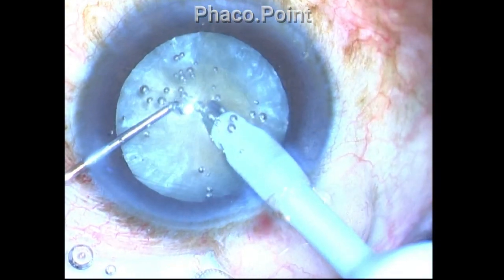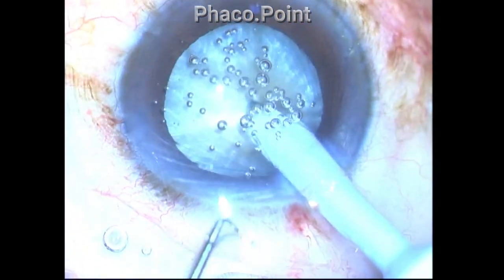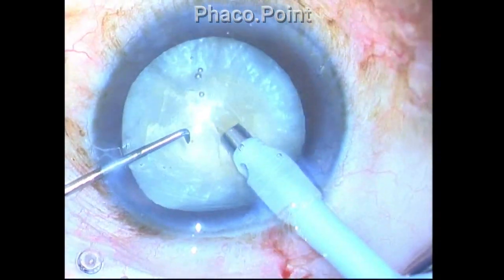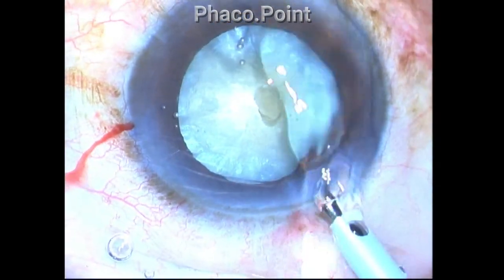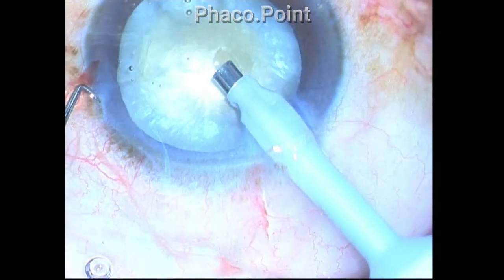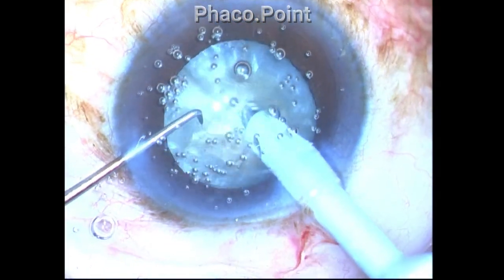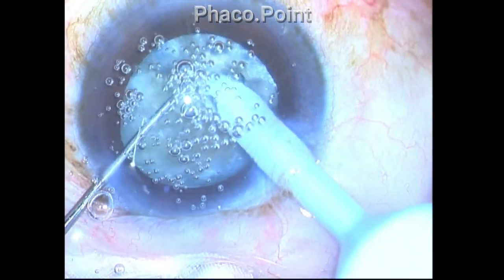I impale the nucleus with the bevel down position to get a good hold, making a small relaxing cut at the conjunctiva because I noticed conjunctival ballooning. And the chamber completely collapsed on me when I went to foot pedal 2. So the first thing I did is I checked whether the bottle height was correct, whether the irrigation flow was okay. And after ascertaining this, I once again went ahead to perform phacoemulsification. But the minute I started the procedure, the chamber kept collapsing.